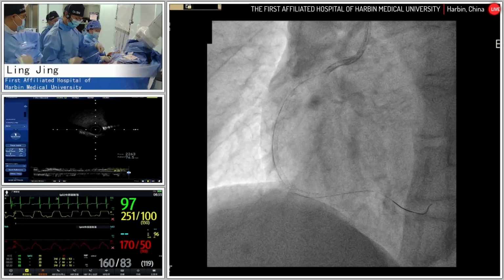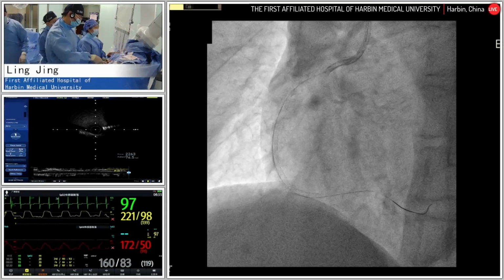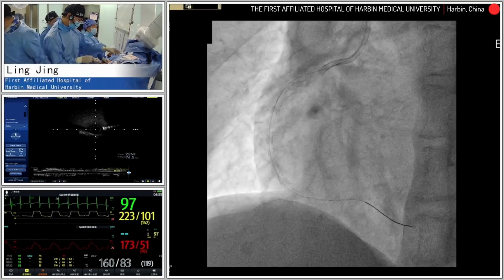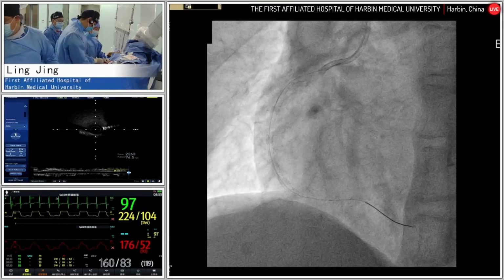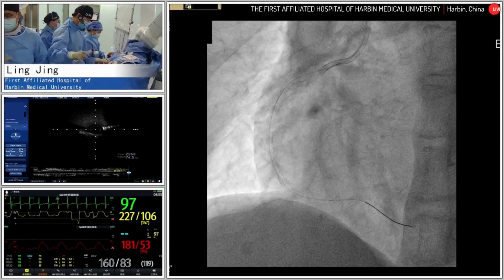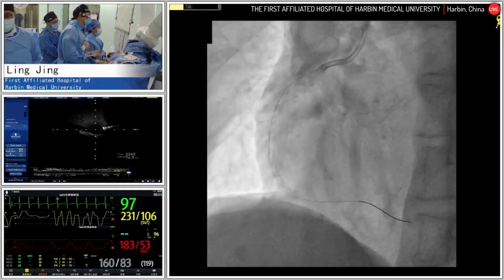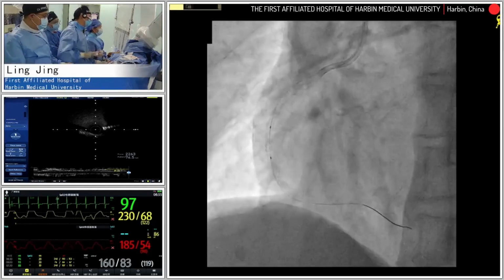2.75. Okay. For this patient, we have performed revascularization of the circumflex and also the RCA. The RAD QFR indicated that the rest can be deferred for some time, so we have finished full revascularization. This is a good promise for the prognosis of the patient, especially for this small lady. I think that CABG for this patient is of potentially high risk. This is a 2.75 NC balloon.